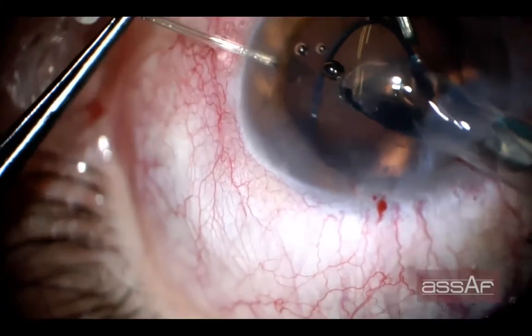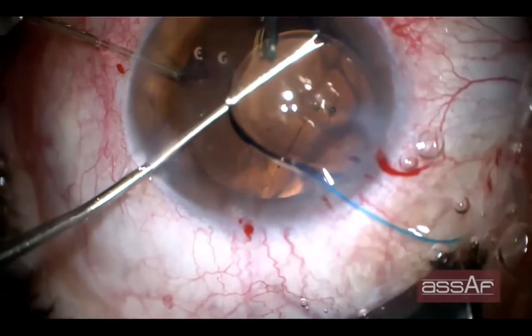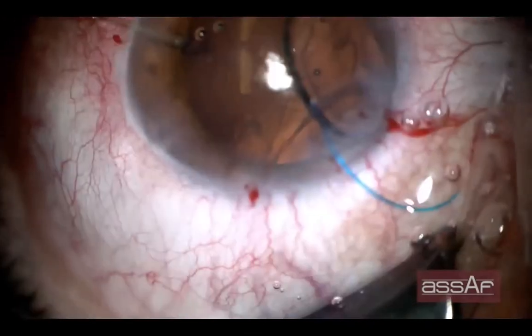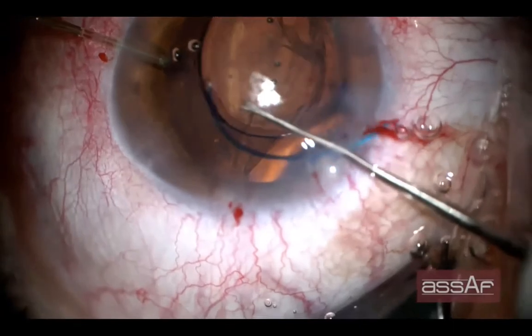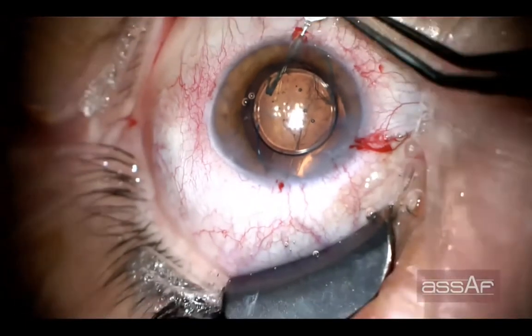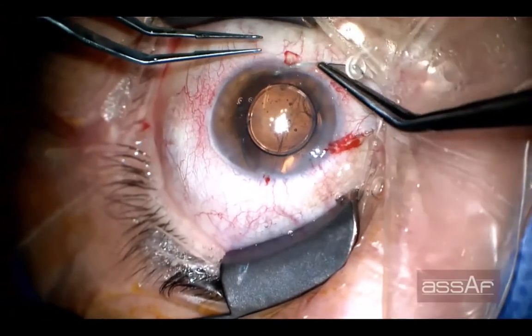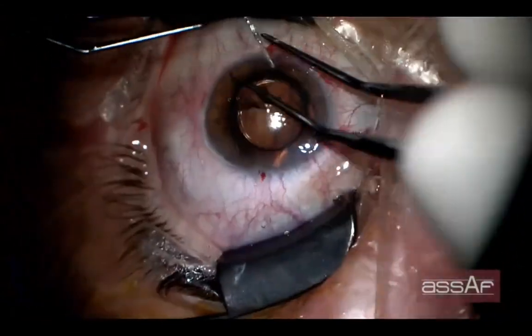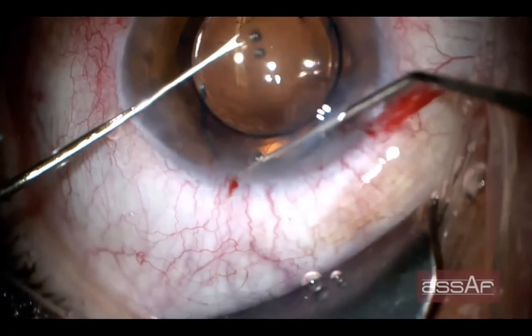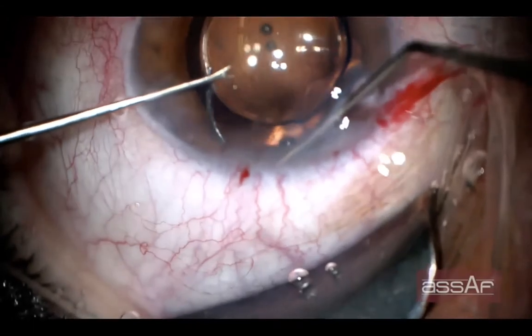The first step is to implant the 3-piece IOL inside the anterior chamber. We had to remove or loosen some of those capsular hooks in order not to interfere with the orientation of the leading and trailing haptic inside the anterior chamber. So the first step is to implant the lens inside the anterior chamber over the iris, and it's time now to remove all the capsular support system. There is no need for it anymore, and then we can place the lens in the sulcus by flexion of the haptic with the aid of the Sinskey hook to place the haptics from the anterior chamber into the sulcus one at a time.